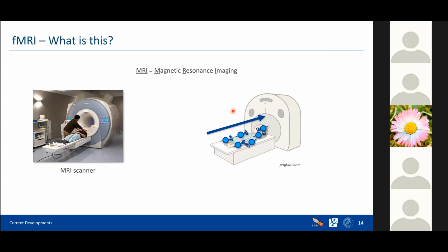And this is how we can do imaging, because the changes in these phases depend on the tissue. Whether you look at the liver or at the brain or at the foot or whatever. So by this technique, of course, it's much more complicated, and this was the explanation for my grandma. But by this, you can do magnetic resonance imaging.